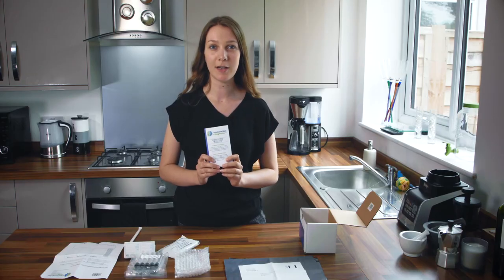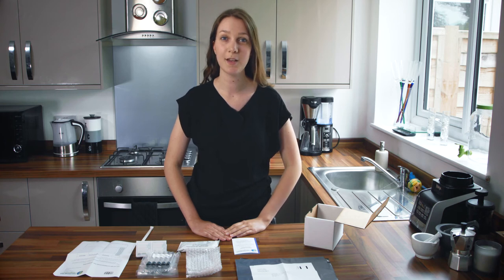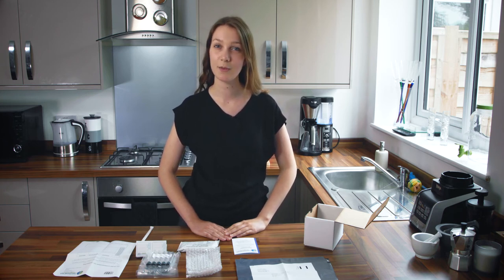Before you begin your postal breath test, make sure to read the enclosed instructional booklet carefully. This booklet includes details of preparation you need to follow before your test. By following this preparation exactly you can ensure that your results will be most accurate. For four weeks prior to your test you should not take any antibiotics. For one week prior to your test you should not take any laxatives or pro-motility agents, but you may continue with any other essential medication. For the 24 hours before your test, specific preparation must be followed — a 12-hour specific diet followed by a 12-hour fast. The diet is the white food or low fermentable diet, which ensures that when you begin your breath test your baseline levels of hydrogen and methane will be low.